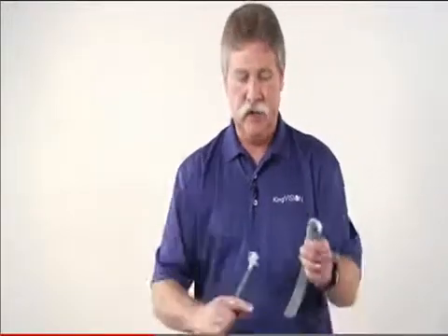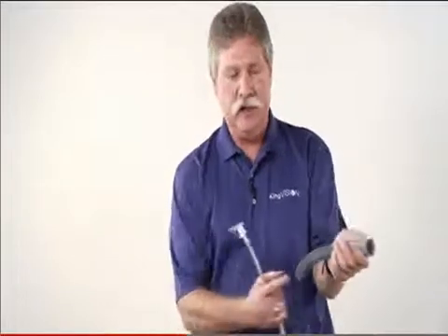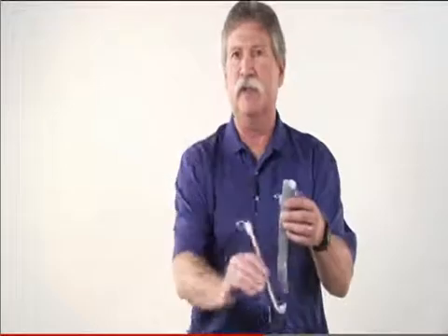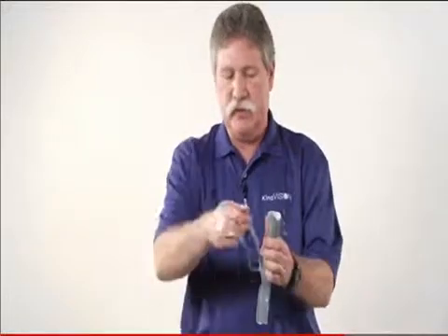It depends on which version you're using. If you're using the standard blade, clearly lubricating the stylet is important, and depending on the level of secretions in the patient, you might want to lubricate the tip of the blade a little bit. You certainly want to avoid getting any lubrication that might cover up the lens. And you might lubricate the tip of the tube a little bit so that it slides through the vocal cords very easily. With the channeled blade, a little bit different. You don't have the stylet. You'll probably want to lubricate the outside of the tracheal tube a little bit to make sure that it glides through the channel relatively easily. Again, a little bit of lubrication on the tip, and maybe even on the bottom side if it's a tight airway.